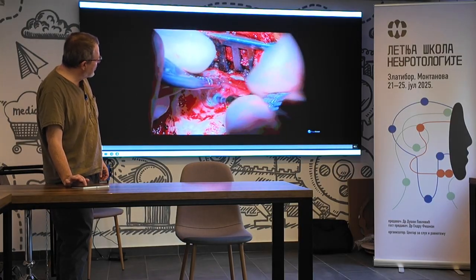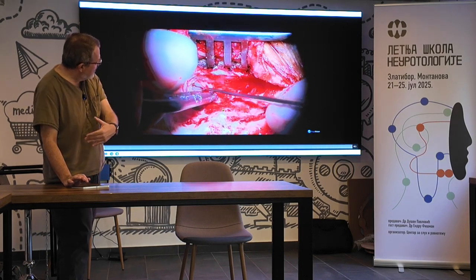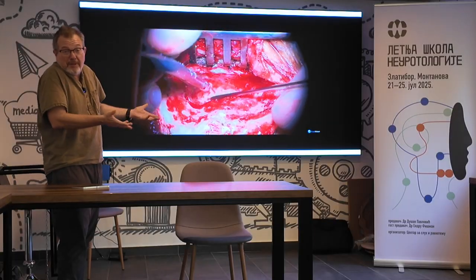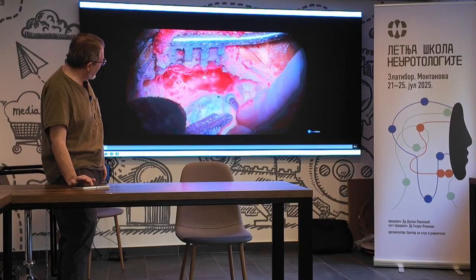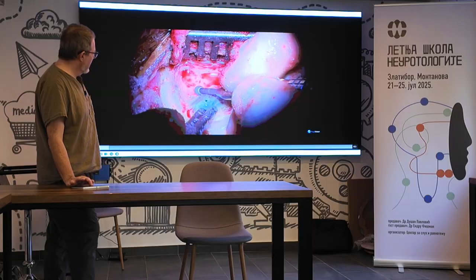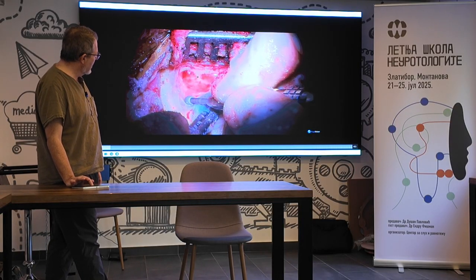It looks very similar to the previous operation. In earlier phases, many of these patients will have had a shunt, and that also helps speed up this operation because a lot of the anatomy has already been exposed. But I have to open the sigmoid sinus and reduce it down out of the way to get to the balance canals, which are here.